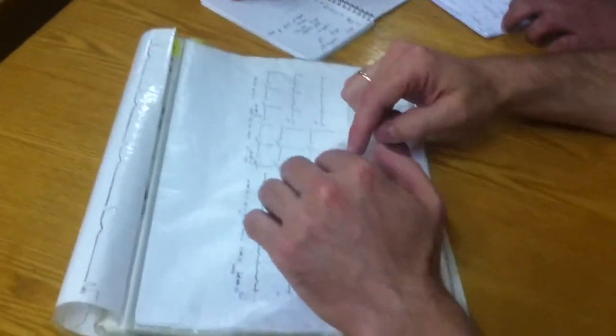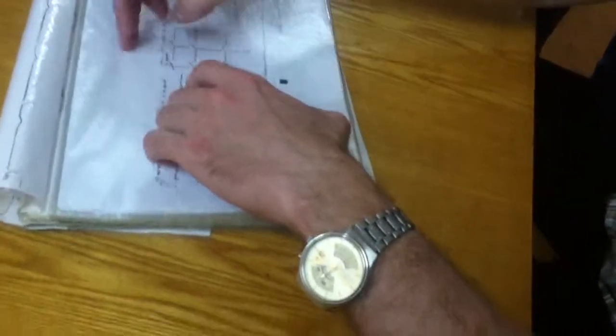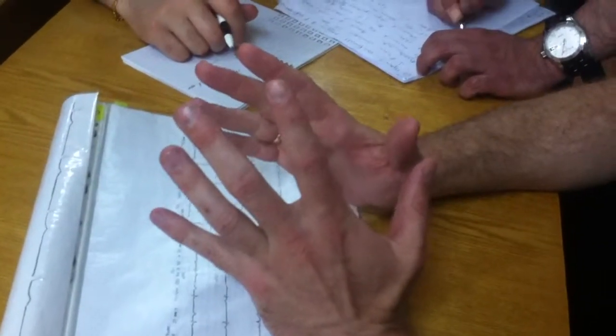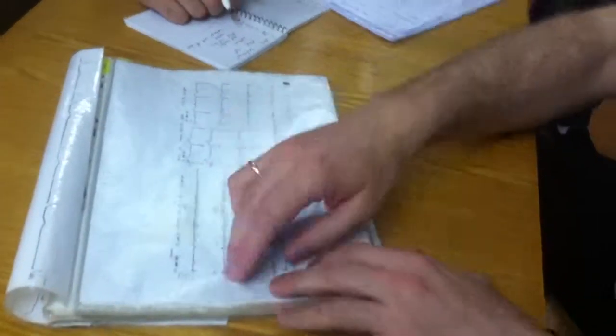Atrial flutter differs from atrial fibrillation in the amplitude of the F wave. In atrial flutter, the F wave is high amplitude, and QRS complexes are narrow. After you determine which rhythm, you conclude: the rhythm is, for example, sinus or atrial fibrillation. So you say about the rhythm. Then you analyze the ECG in all leads, comparing with the normal.